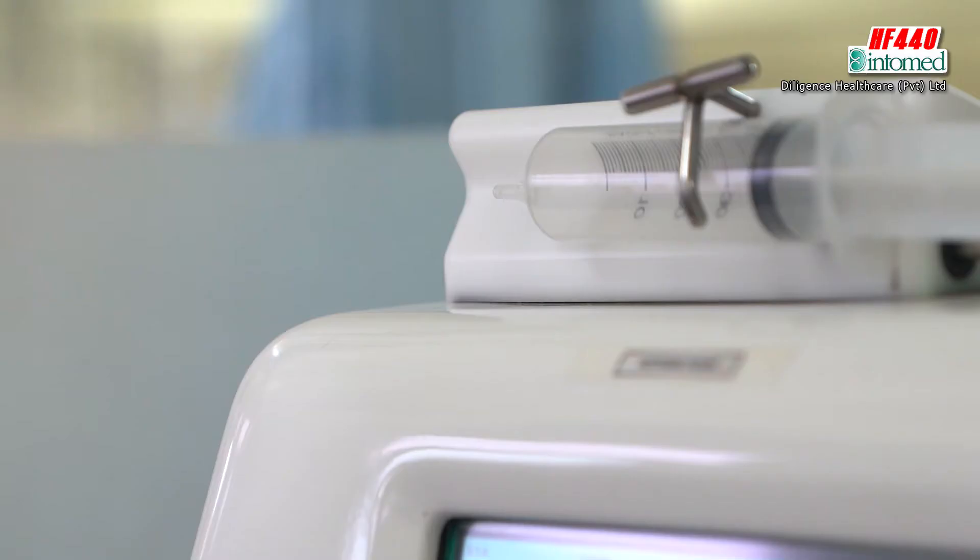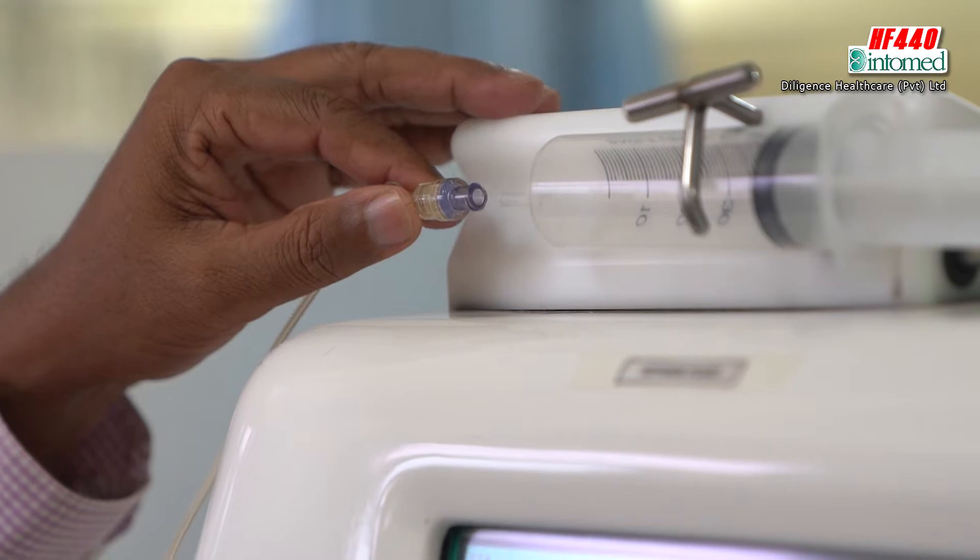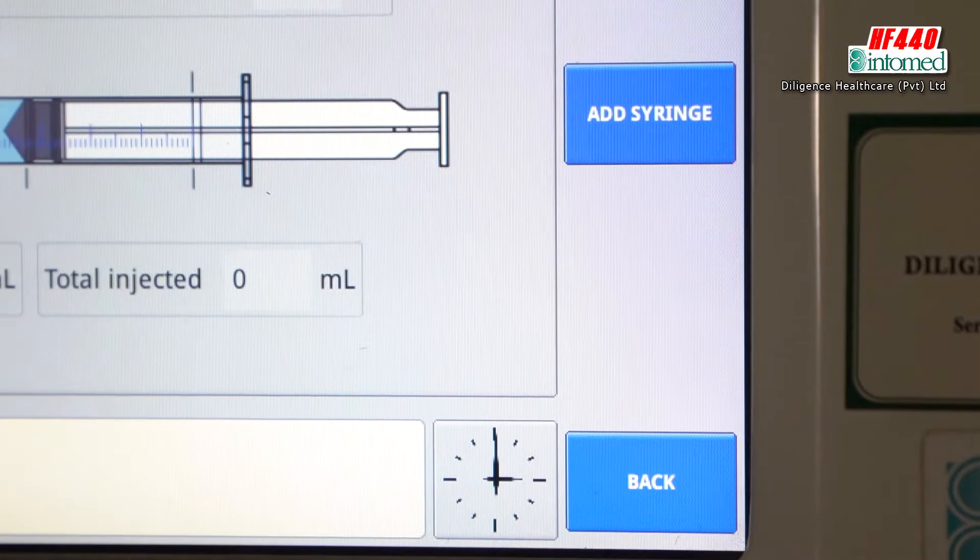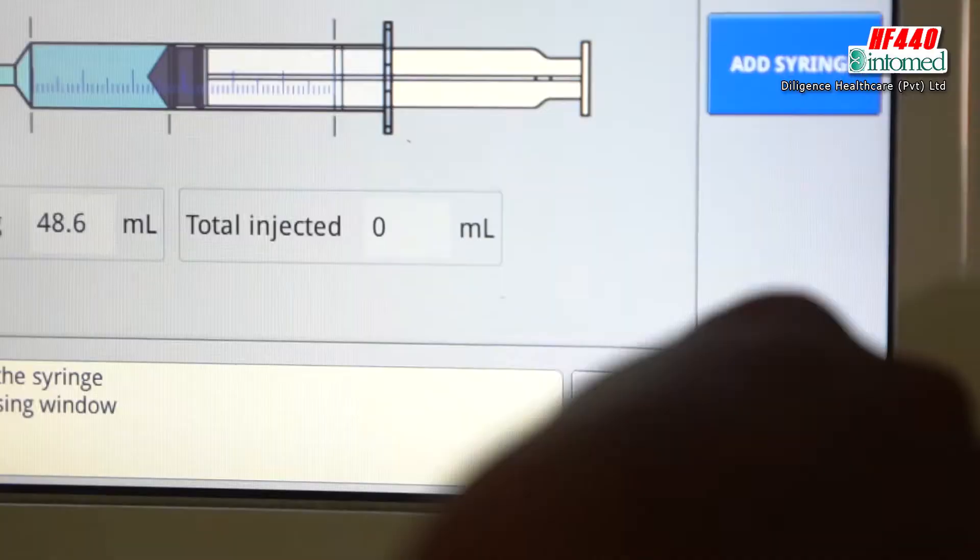Then fix the syringe and you can insert volume to be injected during the rinse, whether it's maybe 10 or 8 or whatever. But you have to understand it won't be going to the patient, then no interference about the patient.